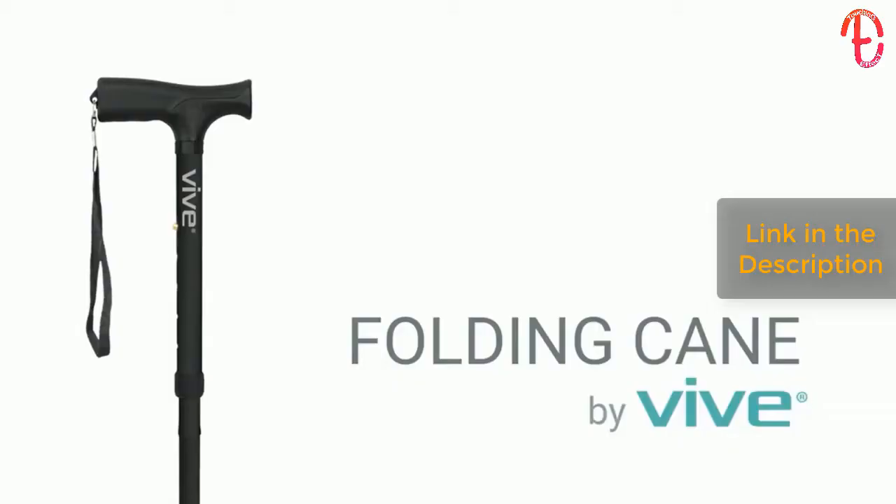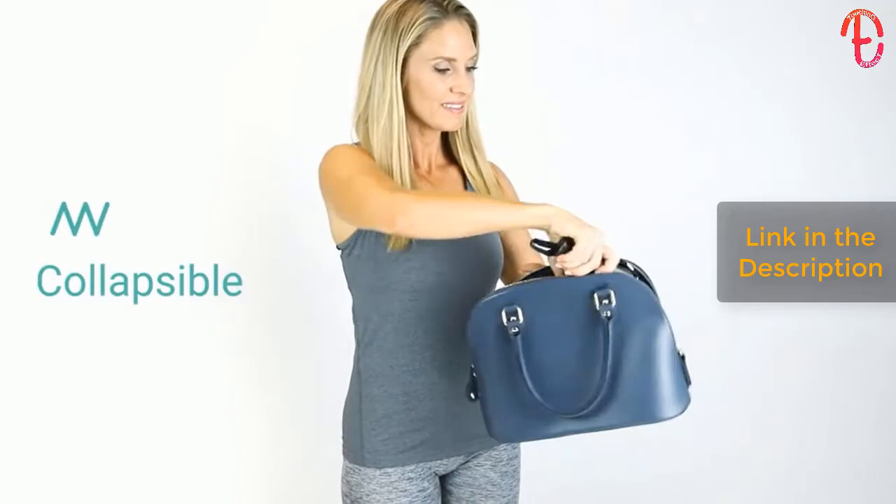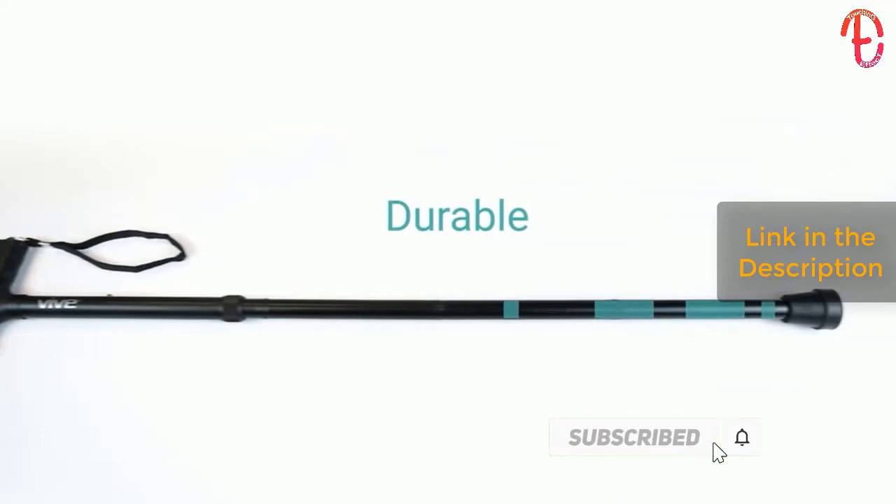The folding cane by Vive provides the perfect combination of stability and support while walking on any surface. Folding at three points, the collapsible cane is compact, easily fitting into your bag. The adjustable anodized aluminum frame is lightweight and durable, supporting up to 250 pounds.